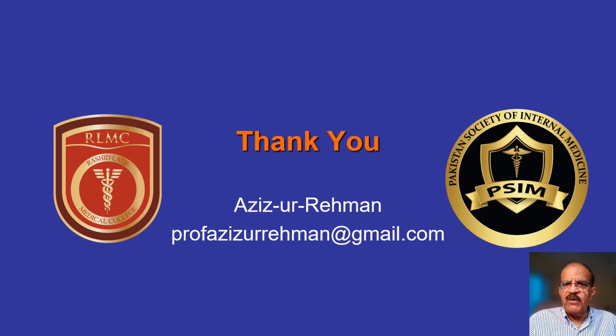So this was all for today. We have discussed anterior wall infarction, acute phase, relatively less acute phase, and we have also discussed the lateral wall infarction. This completes this module. We are going to continue with ischemic heart diseases. We will cover the inferior wall infarction, the posterior wall infarction, and STEMI and ischemia.